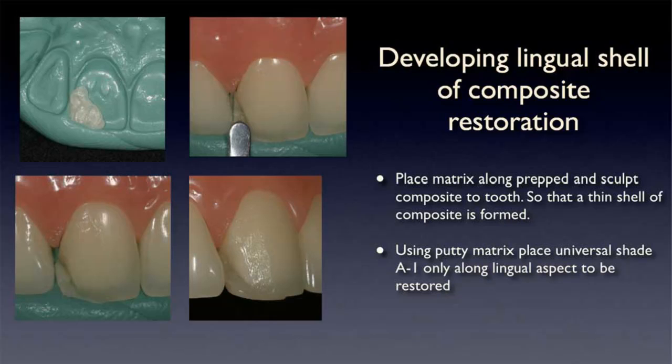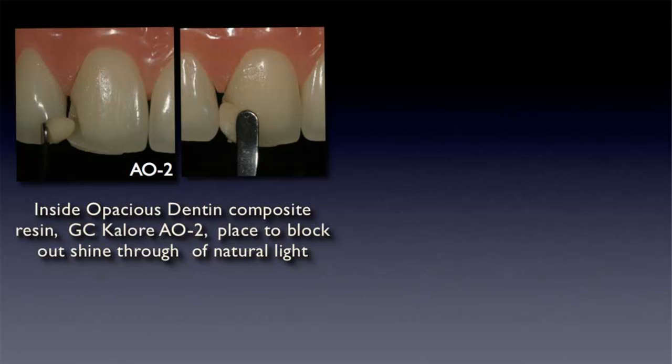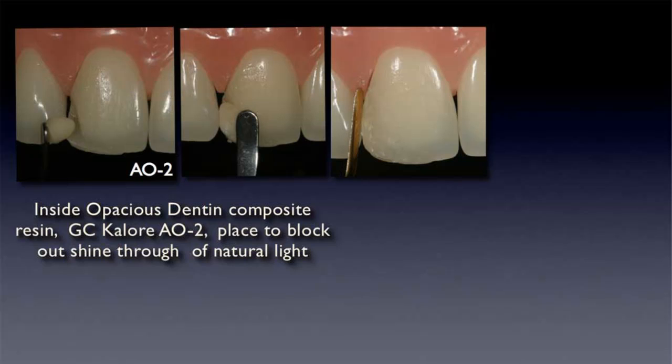Using the freehand technique, what I'm doing is I'm shaping right along in here a little well, so I'm going to place some color. Maybe it could be some gray, it could be some violet color, but I want it to mimic the coloration of what I see along the natural tooth itself. And you can see here, this is the color that I'm using.